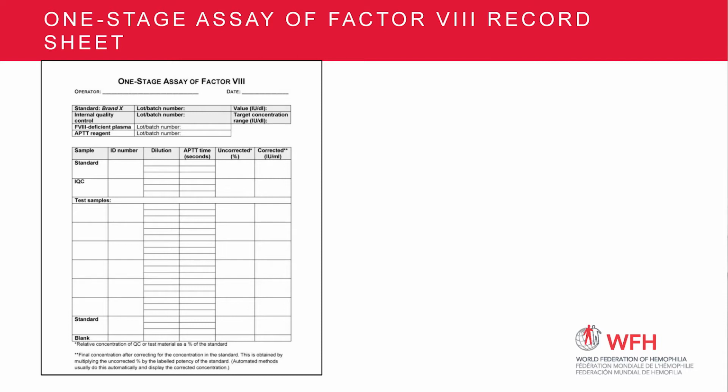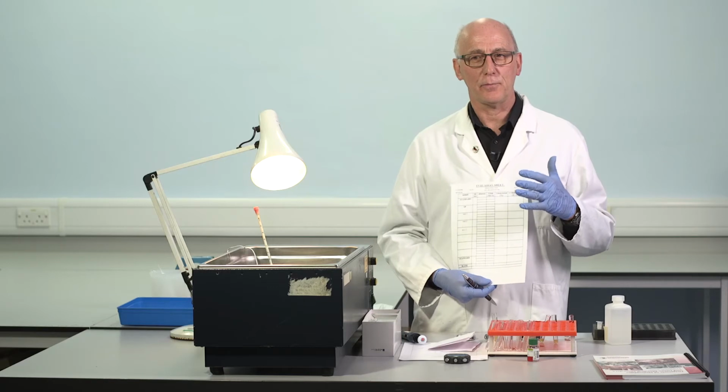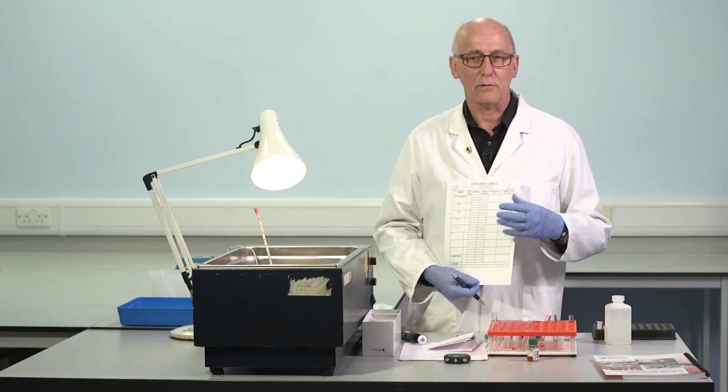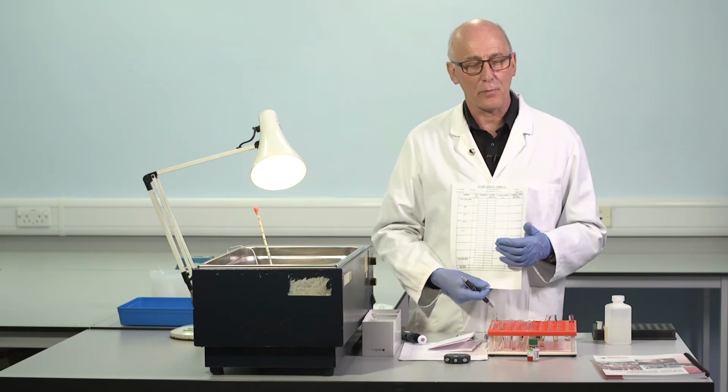In my experience, this is not normally the case. We've successfully moved from different lot numbers of APTT reagent, reference plasma, deficient plasma, and we don't see a difference in the results of our internal quality control. That's unusual. But this allows us to keep track of that information. So that's recorded on this sheet. We record the date of the assay and the operator identification. Who did the test? I think it's important to do this because it may help to identify a training issue if we've got a problem with assays failing or perhaps quality control materials not giving the appropriate result.